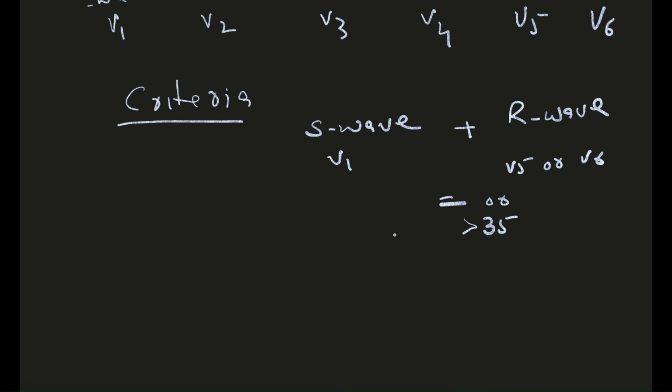If the sum is more than 35 millimeter, then it is left ventricular hypertrophy.